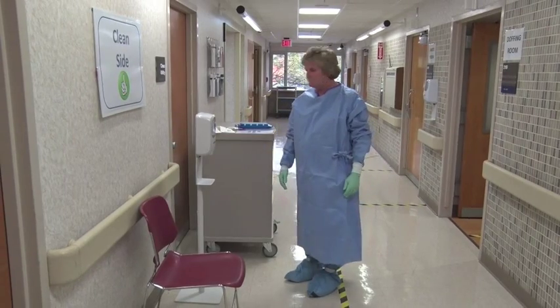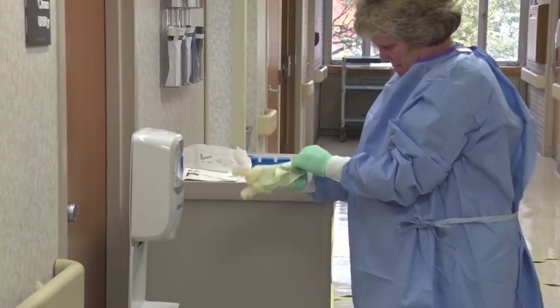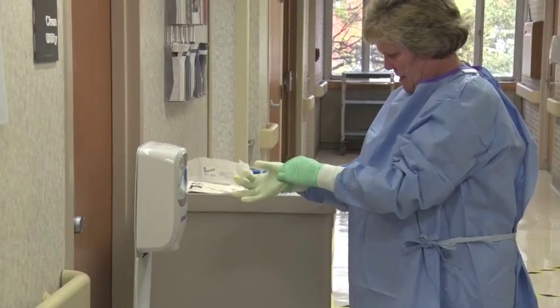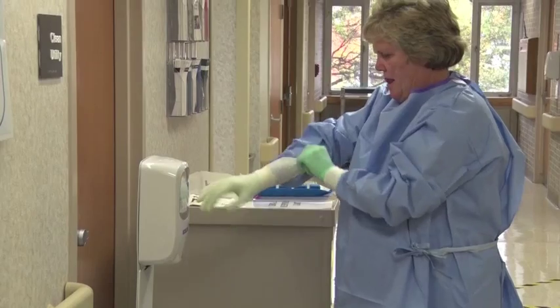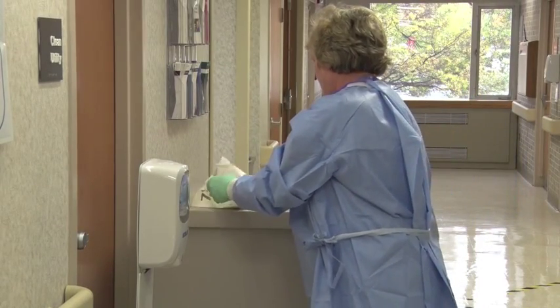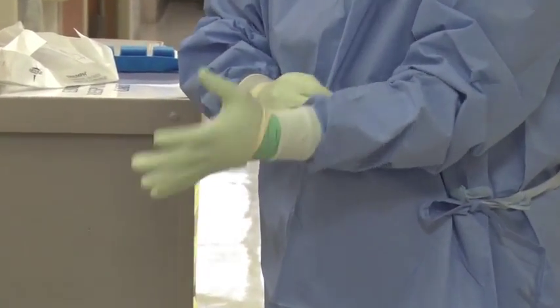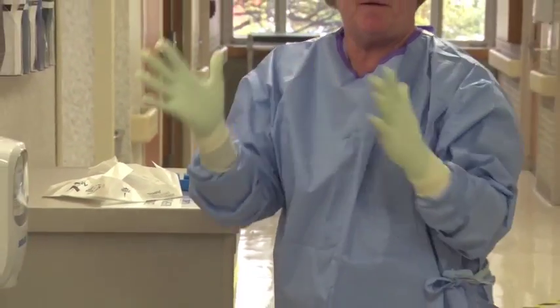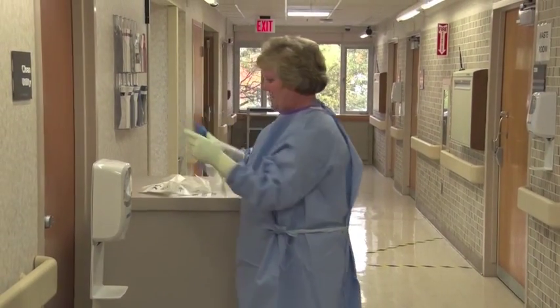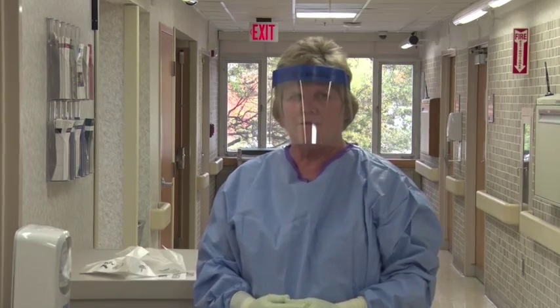Put on the second pair of extended cuff gloves. These are the outer gloves — the Triumph cream-colored surgical gloves. When you put these on, ensure the cuffs are pulled over the sleeves of the surgical gown. Put on the face shield. This concludes the trained observer donning.